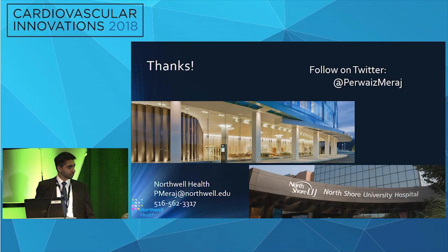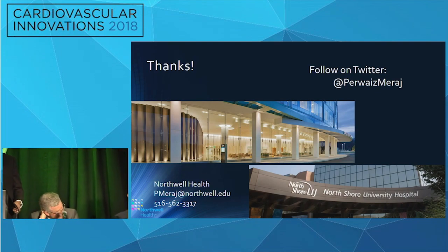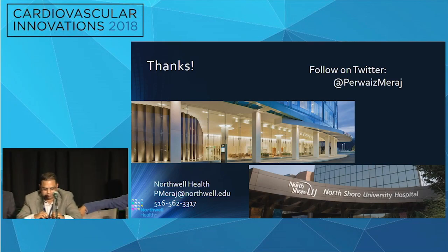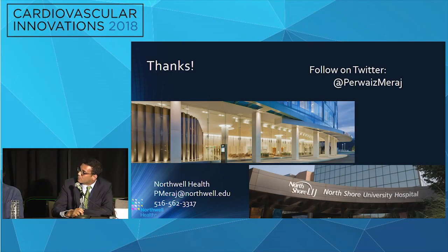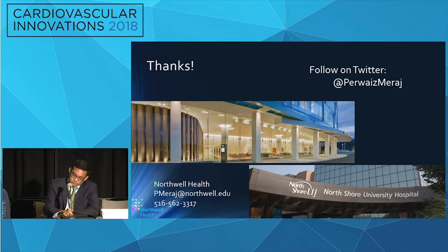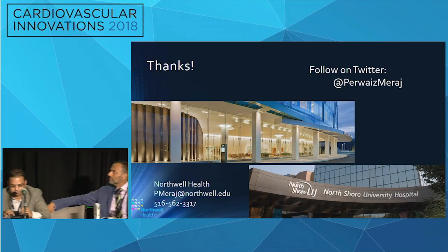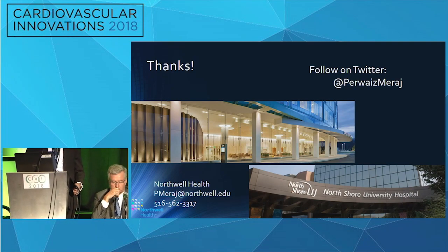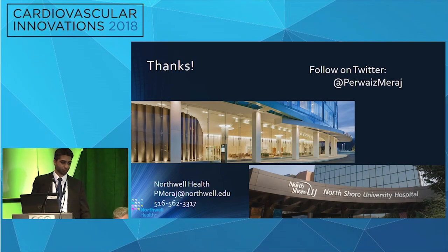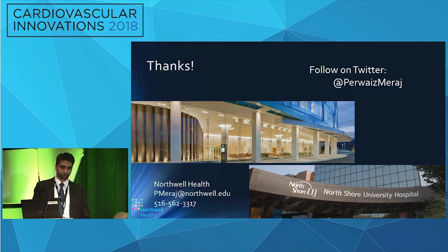With the difference in the particle size that's created by orbital atherectomy and rotational atherectomy, do you recommend more aggressive anticoagulation or a bolus dose of 2B3A with either of them? Not really. I think what we do typically is, with any atherectomy, you're at a risk. I don't care what device it is. You're at a risk for no reflow. We pre-treat our no reflow with whatever drug of your choice is, nicardipine, whatever you decide to use. We pre-treat, we do our atherectomy, we treat again. But we don't change our anticoagulation strategy.